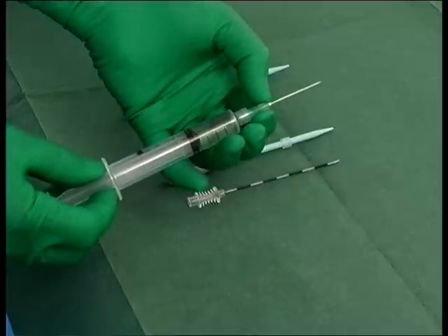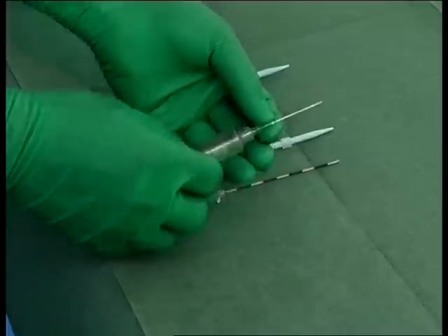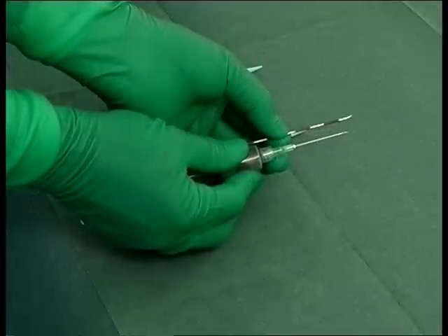During initial infiltration, the green needle is used to assess the thickness of the chest wall. The measurement can now be transferred onto the guide wire insertion needle. Remember to add half a centimetre to ensure clearance of the parietal pleura.